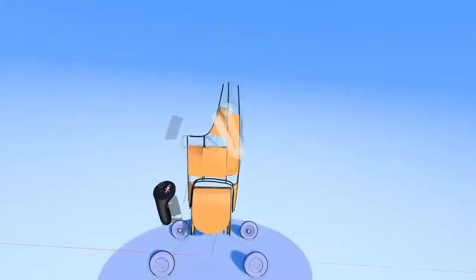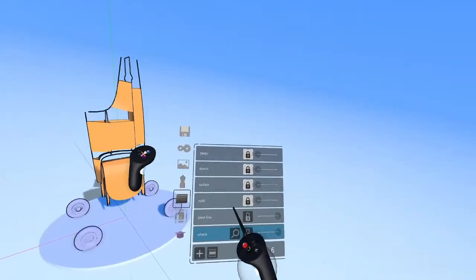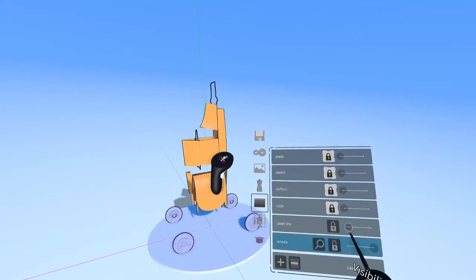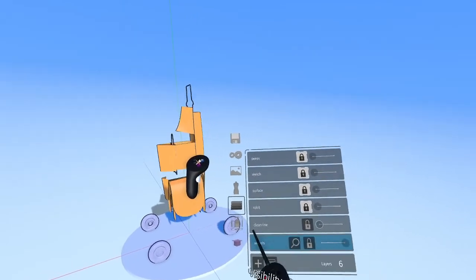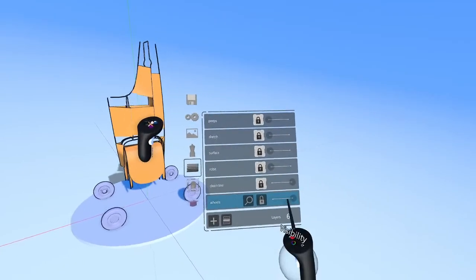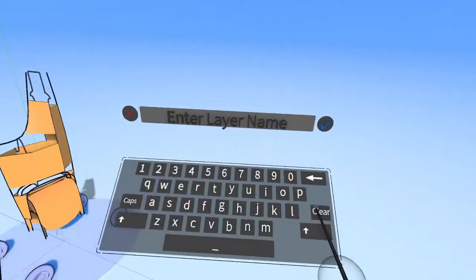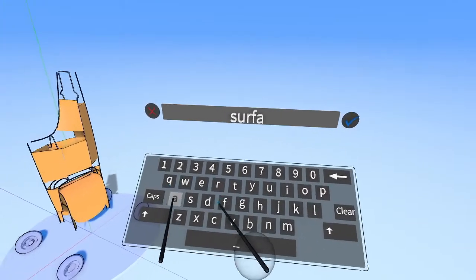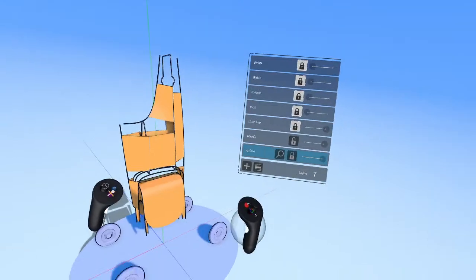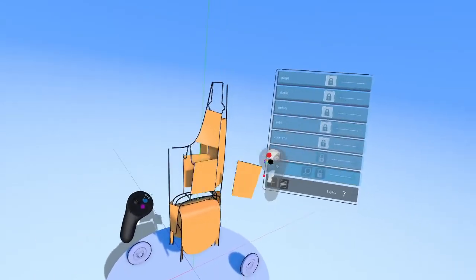And there. So now we have our surfaces, and what I'm going to do is turn down everything else. I'm going to turn down our robot sketch, and we'll leave the curves here, but we're going to lock them. Okay, and so this is my mistake. All of the surface geometry is on the wheels layer. So we're just going to create a new surface layer here and grab these surfaces and drop them on that surface layer.